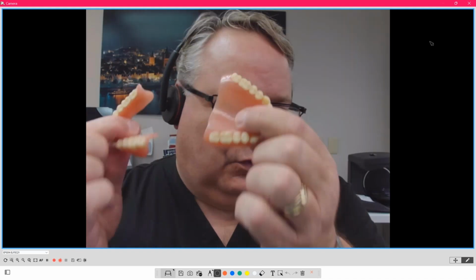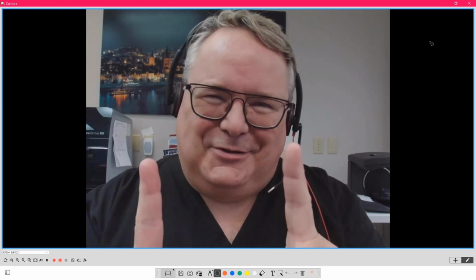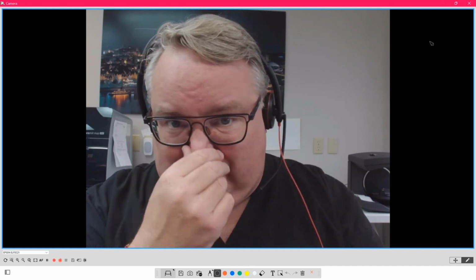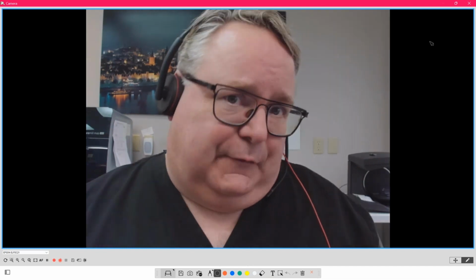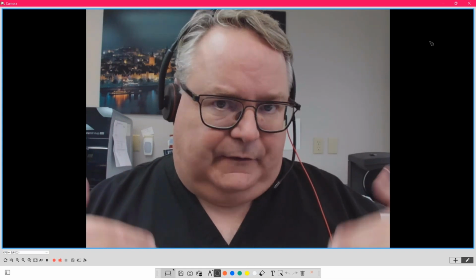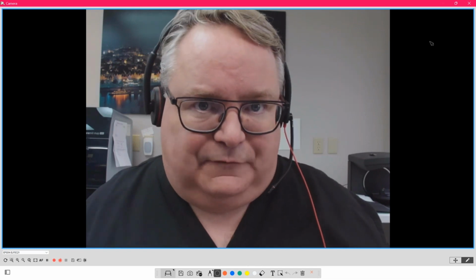When you use milling teeth, which are 0, 10, 20, 30, 33 degree style teeth that work in balance, your average adjustment rate on an upper and lower complete denture, or a full, is 2 to 5 times. So that patient is expected back 2 to 5 times. We accept that in the world of dentures.